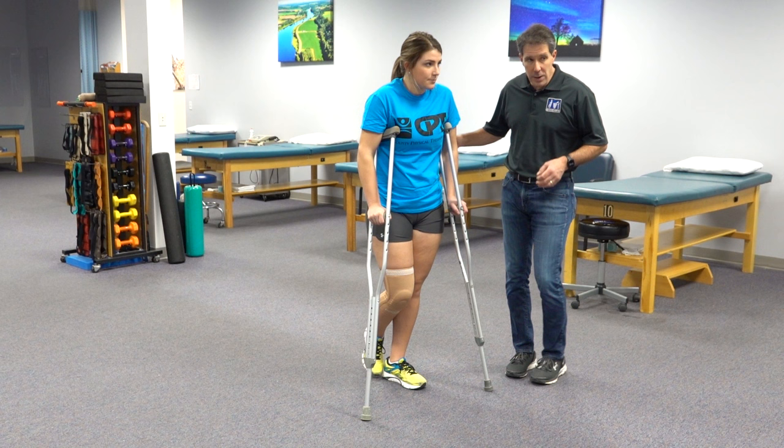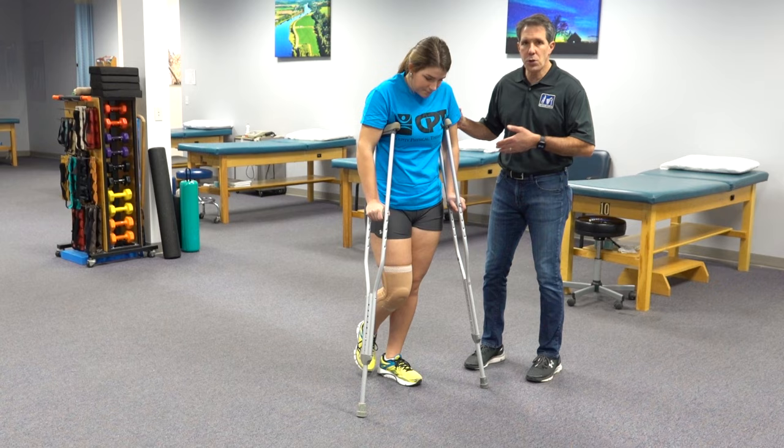Now what we are going to be doing is called a swing-to gait. Good.